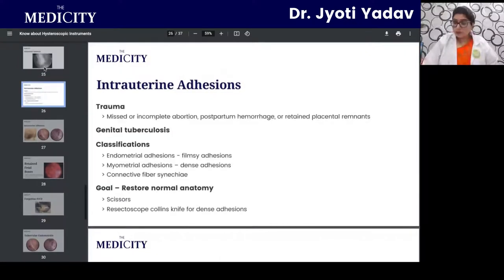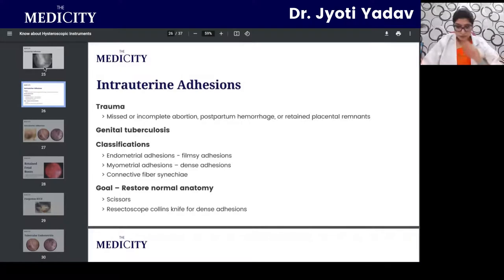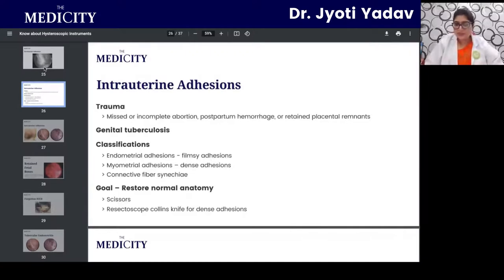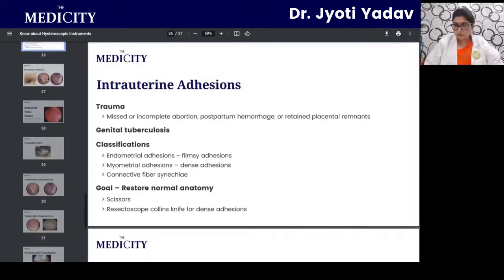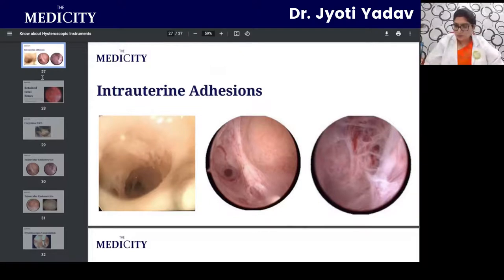Hysteroscopy has proven to be the procedure of choice for intrauterine adhesions. The most common cause of intrauterine adhesions in India is tuberculosis, which is also one of the commonest causes of infertility. Adhesions can also form due to trauma from D&C or PPH. These adhesions are very well tackled by hysteroscopic adhesiolysis. The pictures show a honeycomb appearance of the cavity due to adhesions.